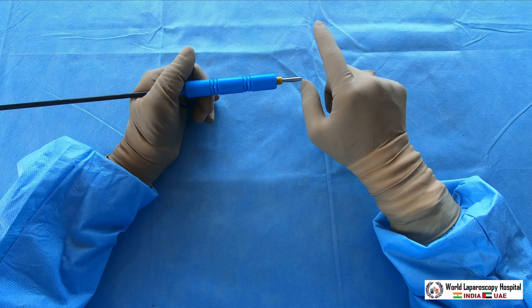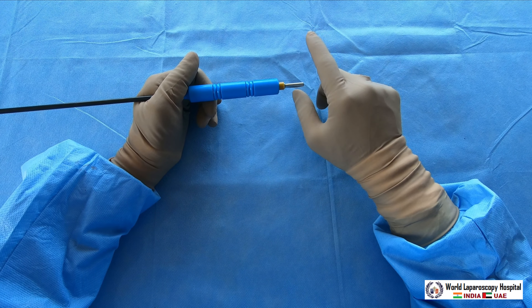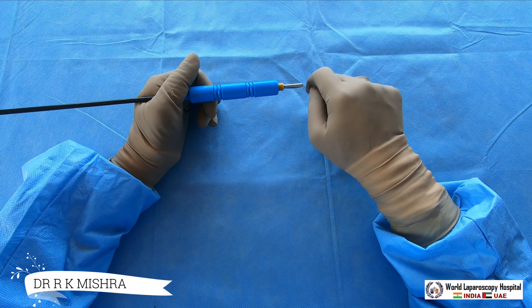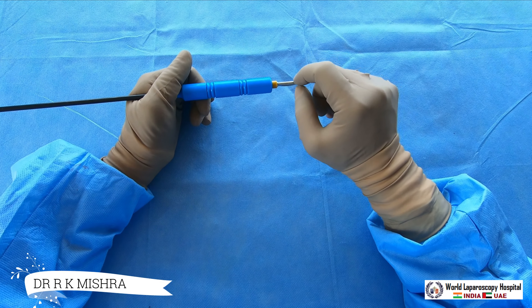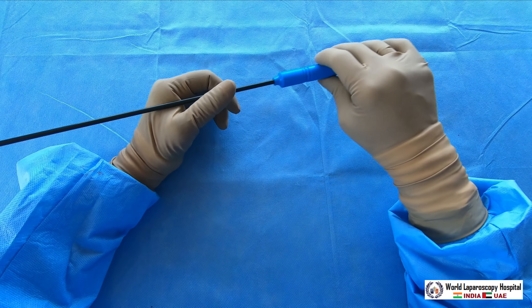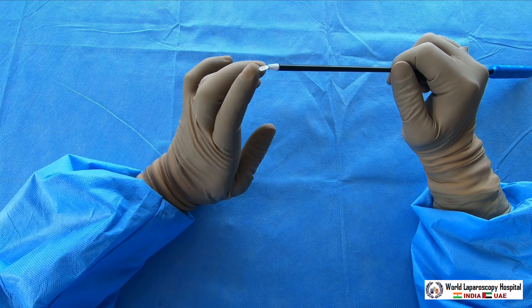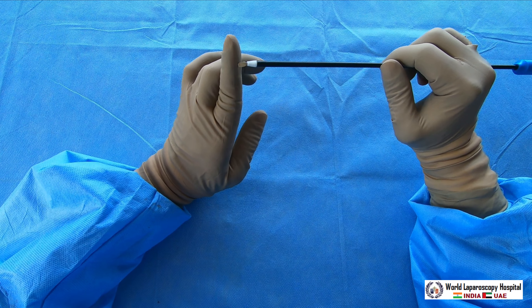Bipolar generally does not cut, and bipolar does not fulgrate either — it only desiccates. But monopolar can cut, monopolar can fulgrate, and monopolar can desiccate as well. So this monopolar spatula is used mostly for stopping bleeding, and the tip can be used for cutting.